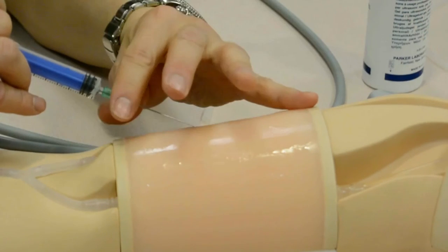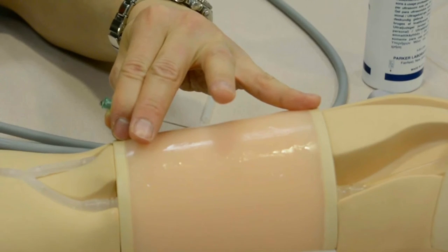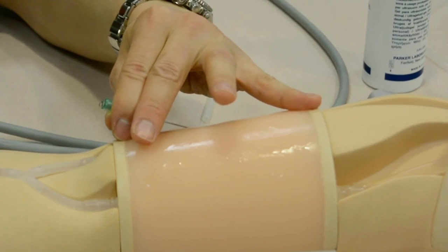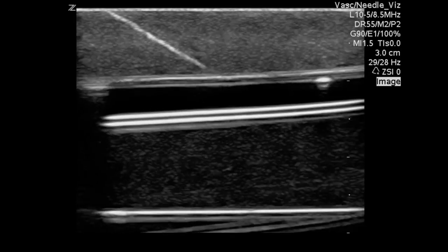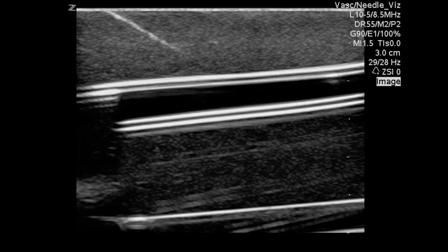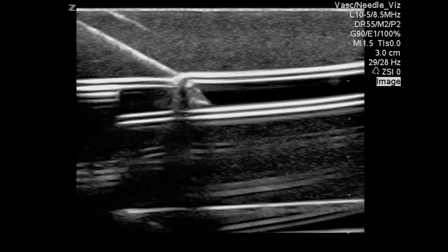We aspirate some of the fluid or blood. In this case the fluid has been left clear so you can see it dripping from the needle — a little bit of flow back because the phantom has been charged with a little bit of pressure. On the ultrasound image, we start off with a transverse image of the vessel, rotate to a sagittal plane, and have a nice view of the vessel. The phantom does retain some scarring from previous attempts. You can see the needle being advanced using in-plane guidance technique into the lumen, aspirating a little bit of blood.